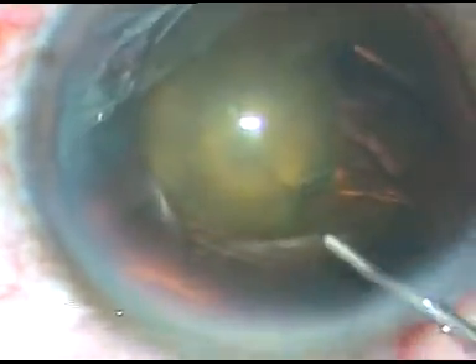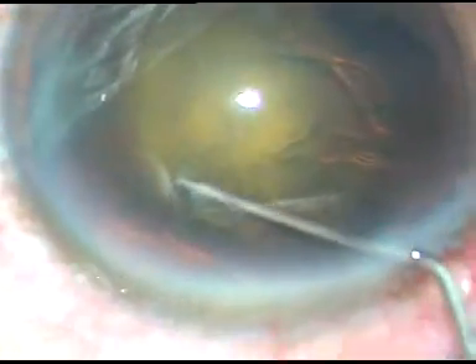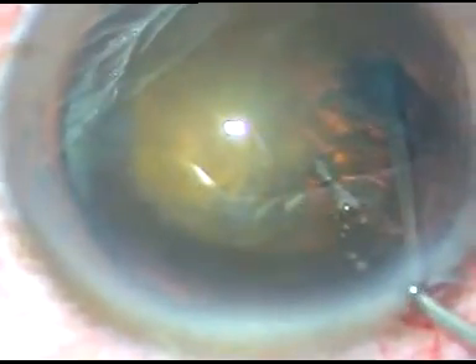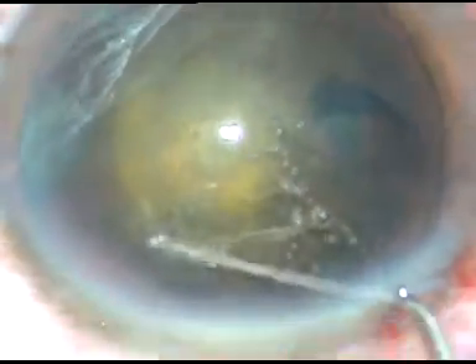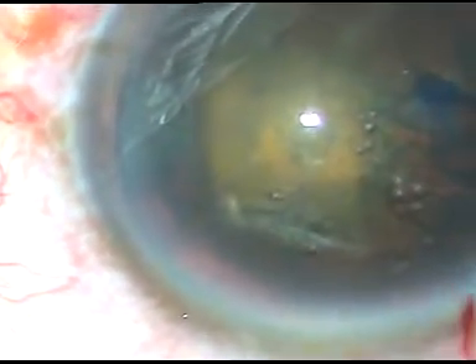Now, I am going to do hydro delineation. I go at a deeper level and then inject the fluid. I go to the other side, scratch the nucleus, and thus I have been able to do hydro delineation. You can see a very faint ring all around.